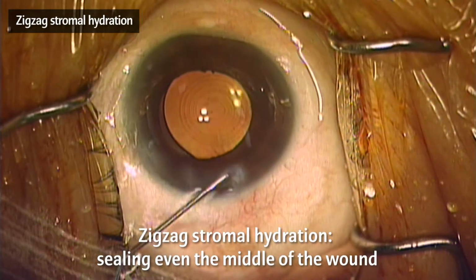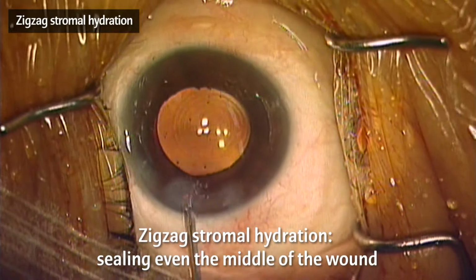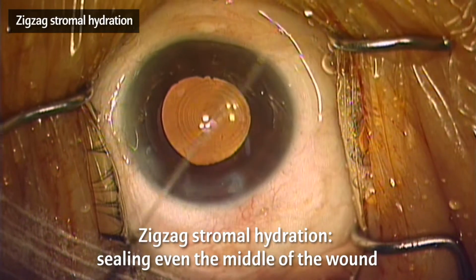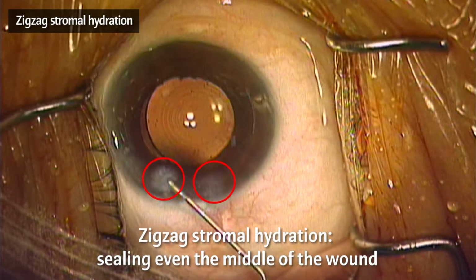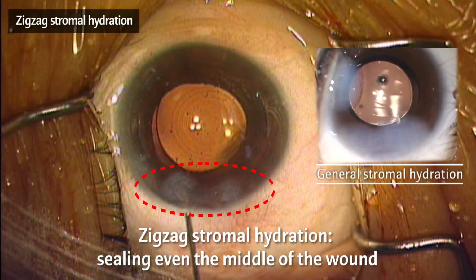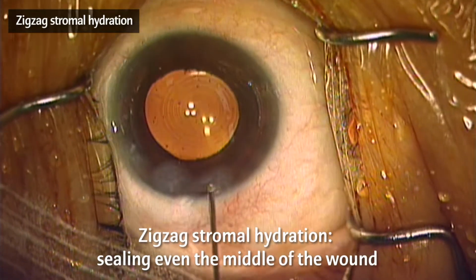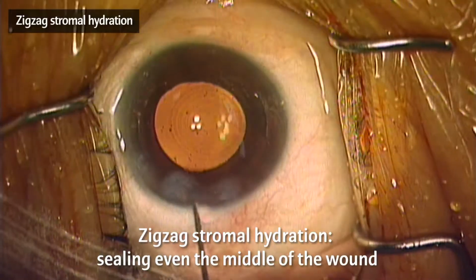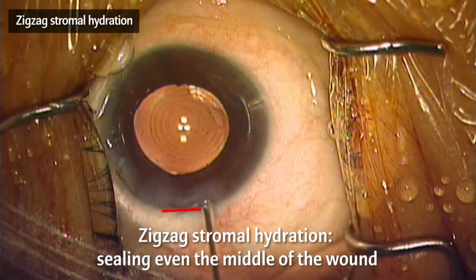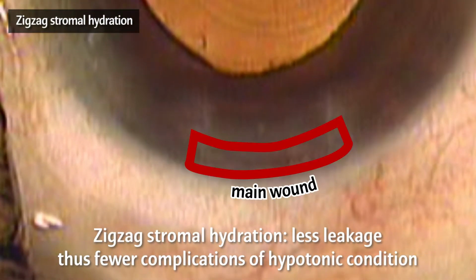Zigzag stromal hydration is recommended to overcome these shortcomings. Zigzag stromal hydration is a method that inflates both ends of the main wound. However, the amount of BSS injected is less than that of general stromal hydration. Then, move the needle sideways, left and right repeatedly at the middle of the main wound in a zigzag while injecting small amounts of BSS. Put simply, it looks like the following figure.